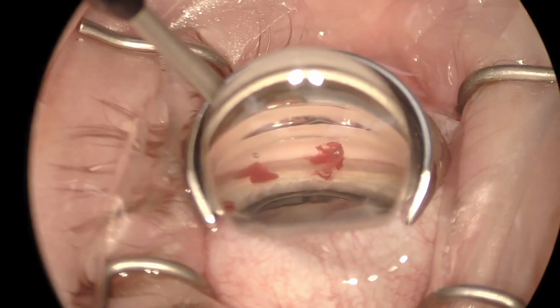Now, if you want to make sure that these stents are in good position, all you need to do is just go in with a little bit of viscoelastic, blow some of that heme away, and you can see that those stents are in good position. I did that in this case, but we don't have it on the video, but that's exactly how you want to go ahead and approach these cases.